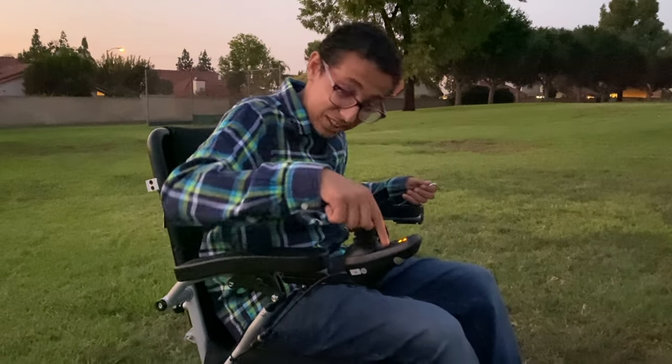It's getting cold at night and it's very dark, but this wheelchair has a flashlight — check it out, it's really cool and so I can see ahead of me.